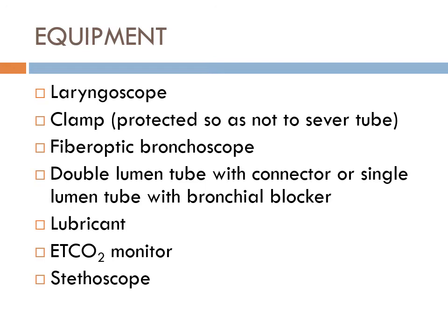I'll probably push this all the way down. So I'm pushing this down, the patient intubated. Push, push, push. And then normally at this point, once that goes through, the yellow is a little bit skinnier than the end. This is obviously pretty thick. I now can share the airway with a bronchoscope. So this other port here has a little cap, so you're closing the area where you're not using the scope. I'm ventilating through the side port when I'm doing a bronch.